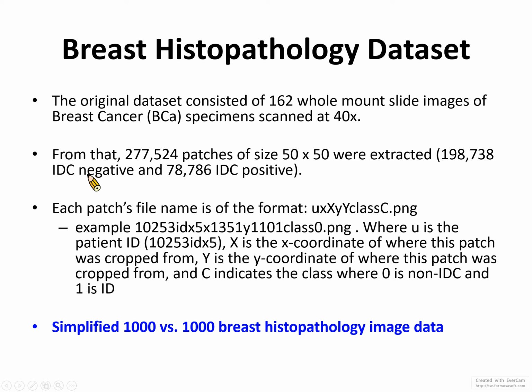So this is just to clarify that this data is solely from patients, and there are no healthy controls in this data. But the healthy control here is the tissue without the cancer cells. You can also say that it is healthy or normal tissue.